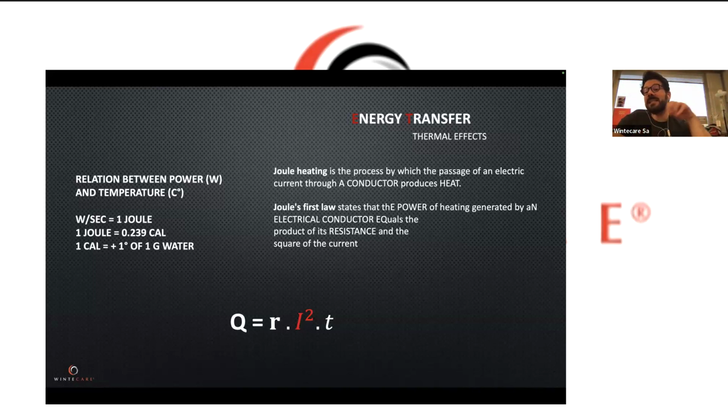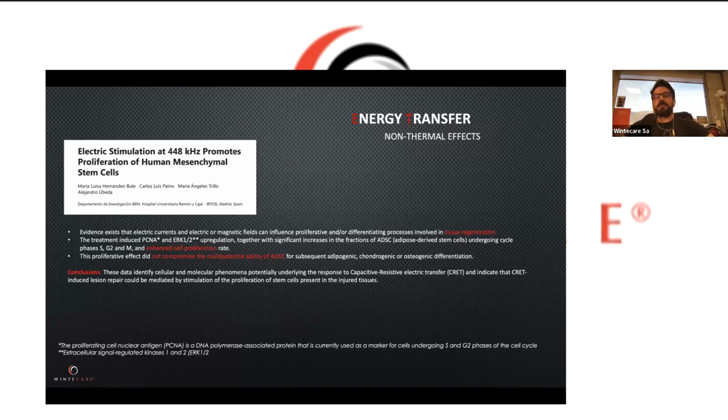It's actually 16 times. 2 times 2 equals 4. 0.5 times 0.5 is 0.25. So 4 divided by 0.25 is 16. So the difference in terms of time impact between a device of 2 ampere and a device of 0.5 ampere is 16 times, okay? And this is value for money, okay? So time is value.